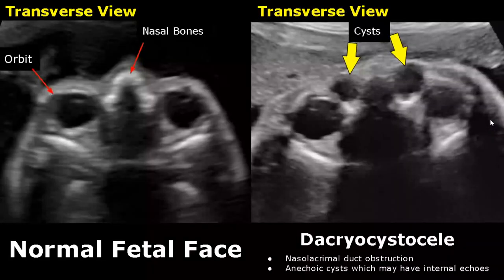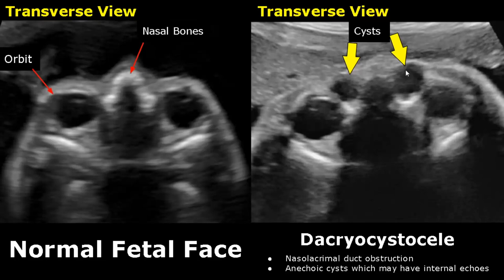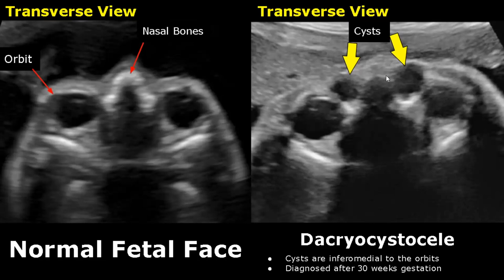Due to nasolacrimal duct obstruction, anechoic cysts may be formed. Sometimes these cysts have internal echoes. This is called dacryocystocele. These cysts are inferomedial to the orbits. We can see these cysts at the location of the nasolacrimal ducts, and they are diagnosed after 30 weeks gestation.